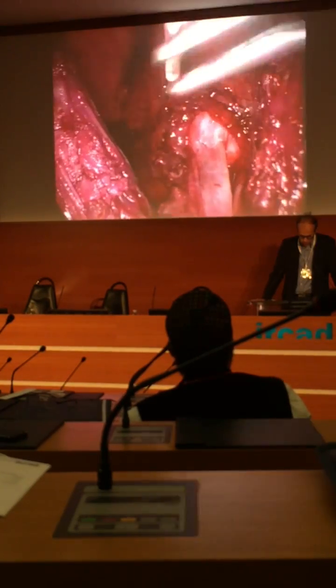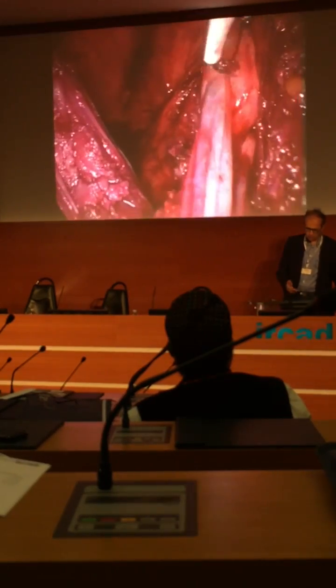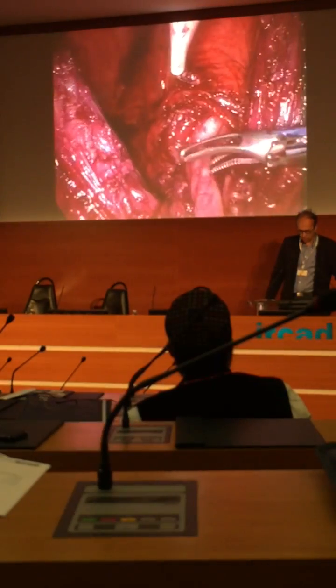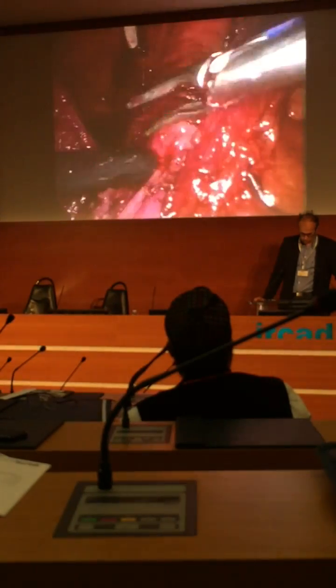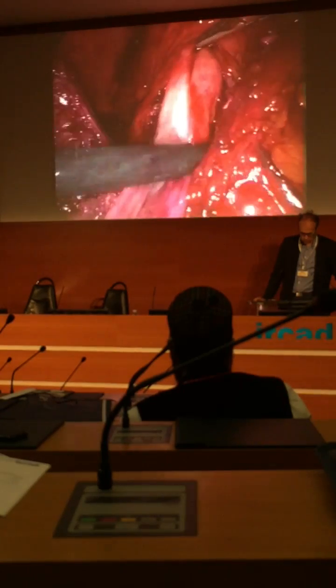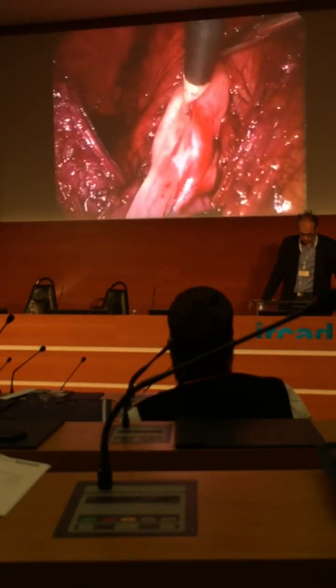In my experience, in some situations, you can be in the wrong space, and it's possible to remove the pseudocapsule also, but then you have the fat which is around the bladder, and you have more bleeding in this situation. And I think it's better if you can remove only the mucosa like in this video.